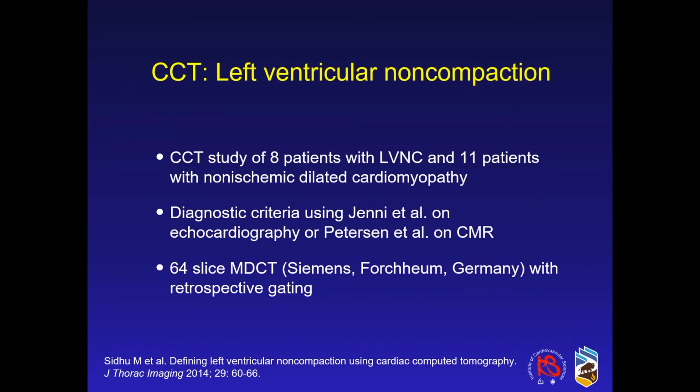In individuals who have poor echocardiographic acoustic windows or contraindications to undergo cardiac MRI, cardiac CT can be used in the non-invasive diagnosis of LV noncompaction. This study by Sidhu et al. from 2014 evaluated CT use in 8 patients with LV noncompaction and 11 individuals with non-ischemic dilated cardiomyopathy. Using the diagnostic criteria of Jenni et al. on echocardiography or the Petersen et al. criteria on cardiac MRI, they did 64 slice CT with retrospective gating in this patient population.